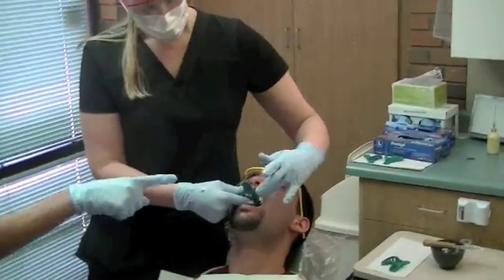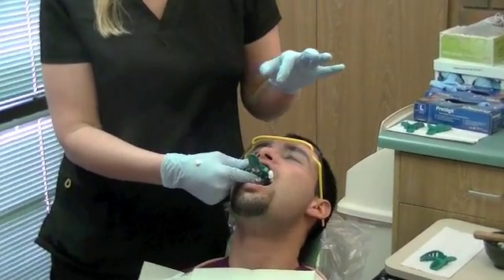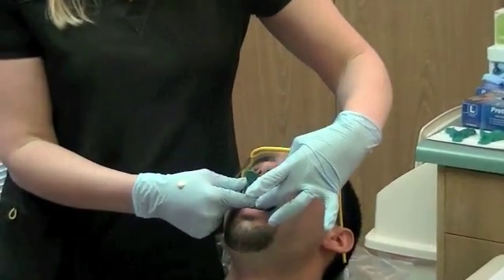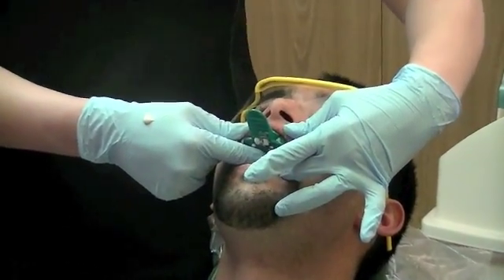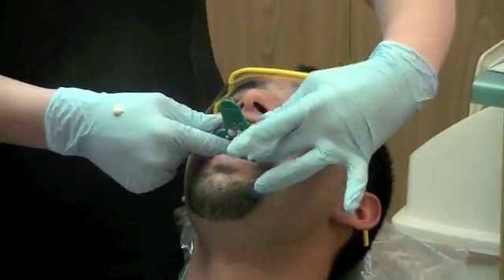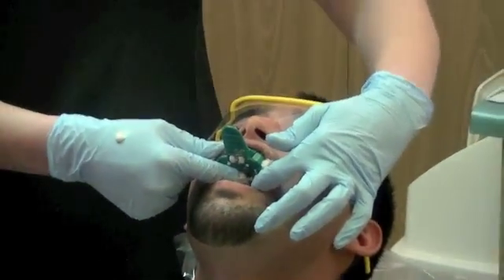You kind of check with the outside — and this is like a rubbery feel, like I showed you at the store. It's going to take a little bit because the water is kind of cold. And if you get a real smart aleck patient who gives you a hard time and he has a goatee, you can just wipe the excess all over that and it'll be real fun to get out.